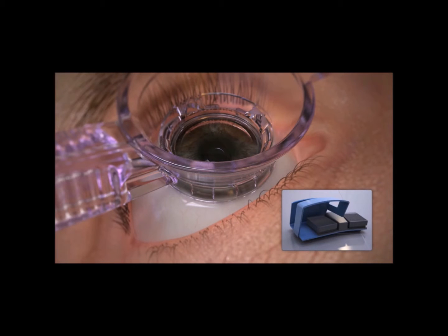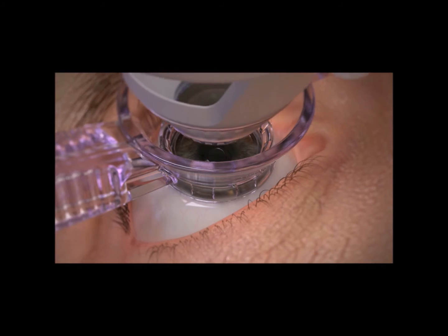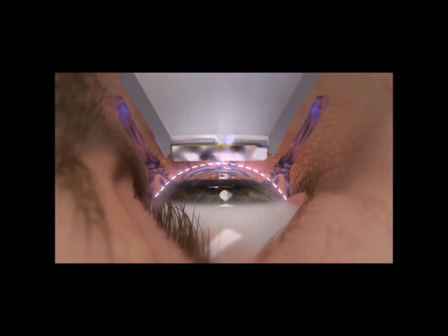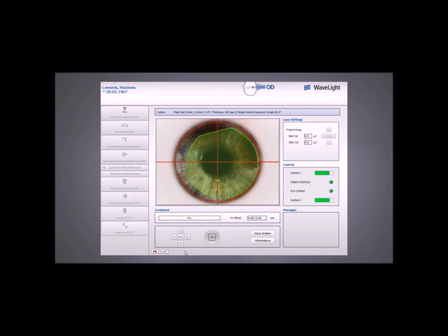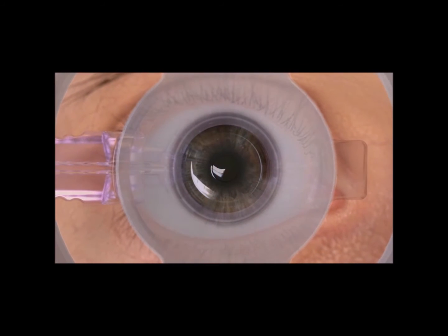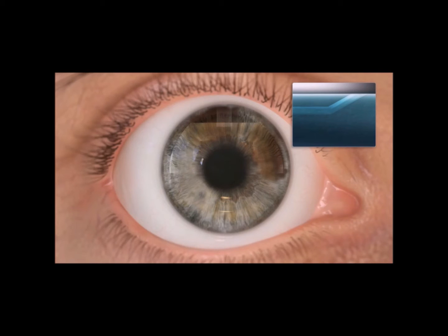If I want a 110 micron flap I'm going to get a 110 micron flap. Placing the eye interface is simple. It's a bit different than other platforms but easily learned. You can rotate the flaps right or left, put the hinge wherever you'd like, and if you're into cyclo-rotating the flaps you can move them wherever you want. Within the red realm is the limitation of what the laser can do, because we're going to get a consistent nine millimeter flap. With each click you're not reducing the flap diameter. We make a pocket to allow escape of gas, to prevent opaque bubble layer and other issues.